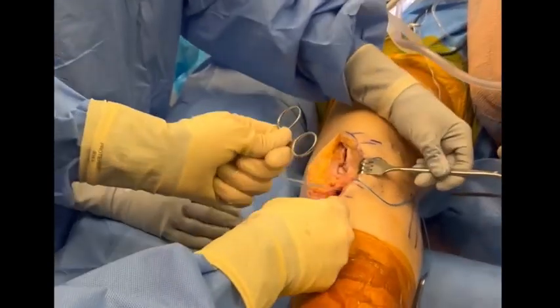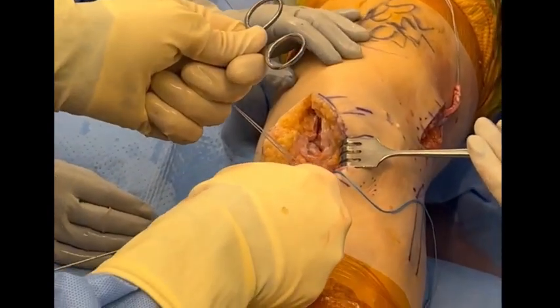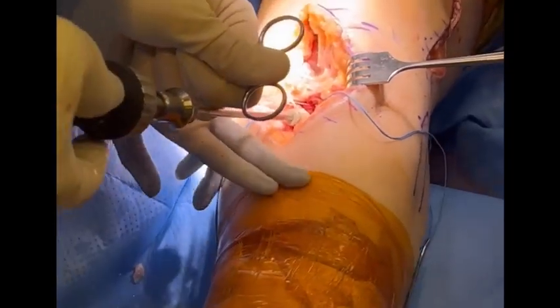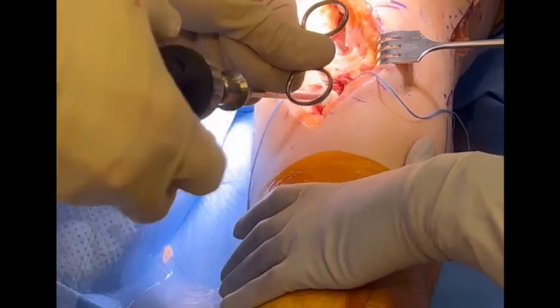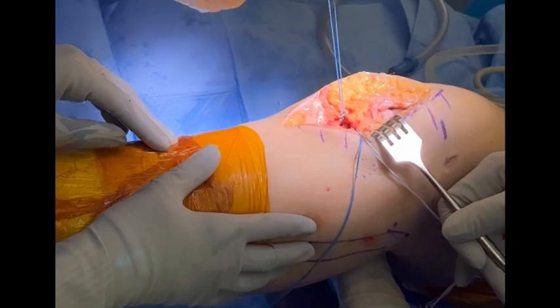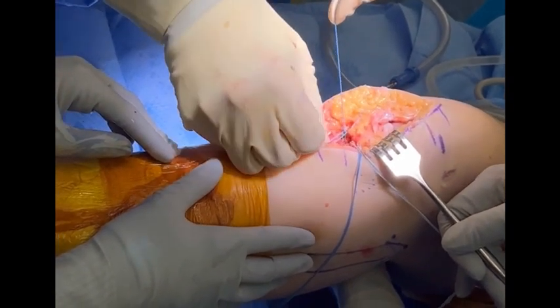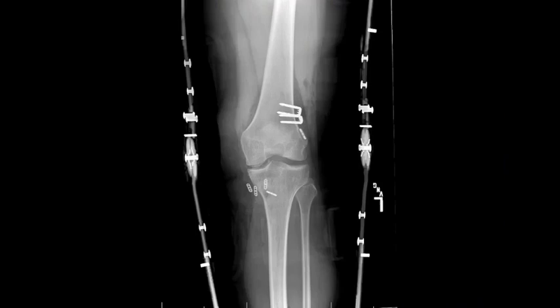The tibial fixation of the ACL graft is performed using an 11 by 25 mm interference screw with the knee in near full extension and axial tension applied on the draw sutures. The graft is confirmed to be stable. The meniscal root sutures are tied over a cortical button at 60 degrees of flexion, ensuring adequate positioning and fixation of the meniscus. We obtain post-operative radiographs in all cases.